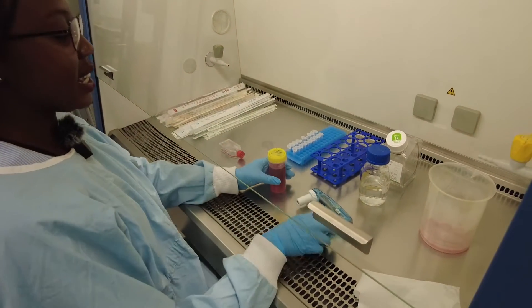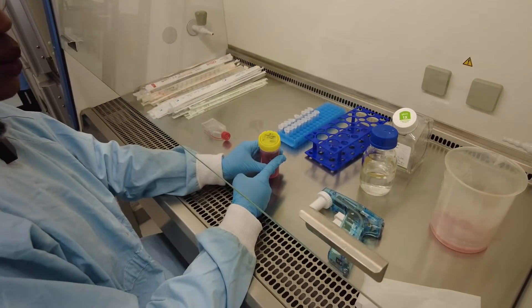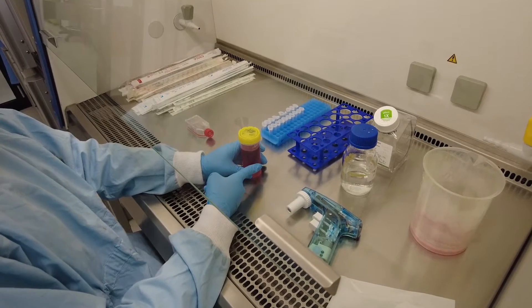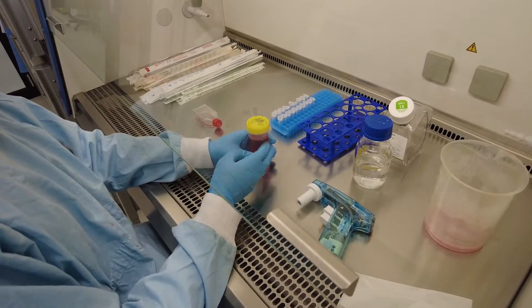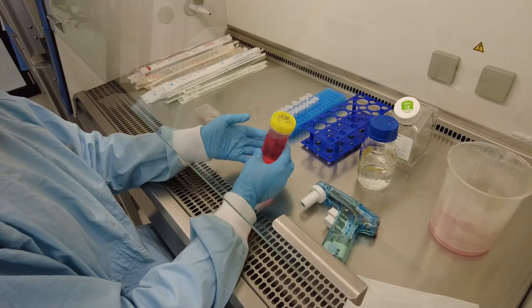This is our media — it's EMEM, a specific media that we use for normal colon cells. I made this up by adding media, fetal bovine serum, and a little bit of penicillin streptomycin to avoid contamination.